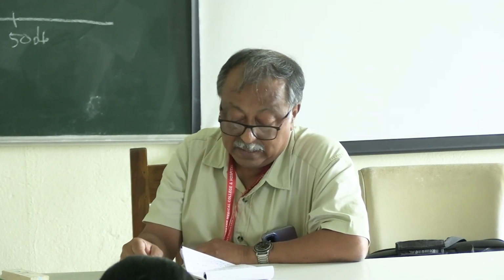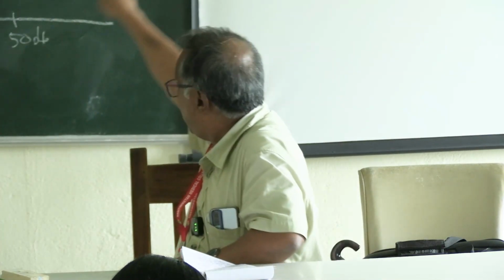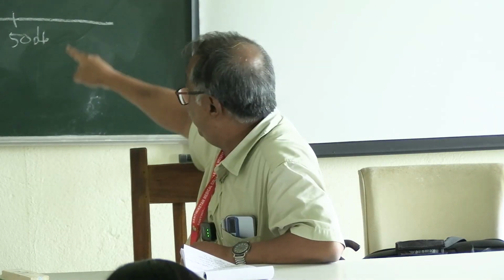The initial difference is maintained in normal conductive hearing loss and neural or retrocochlear hearing loss. The red curve is common for normal, conductive hearing loss and retrocochlear hearing loss. But this blue curve is characteristic of the cochlear pathology.